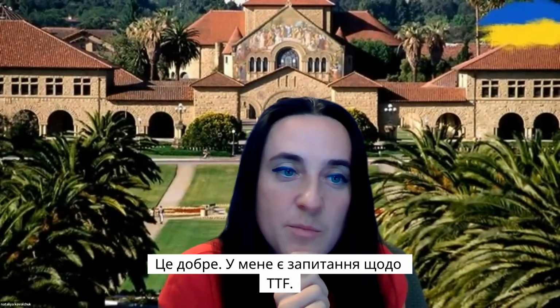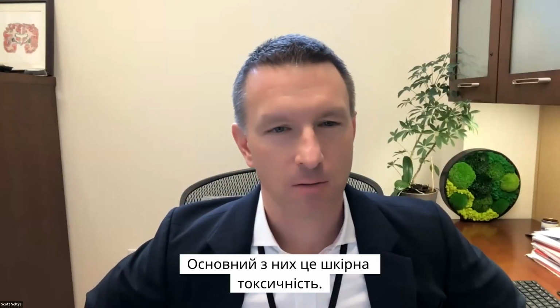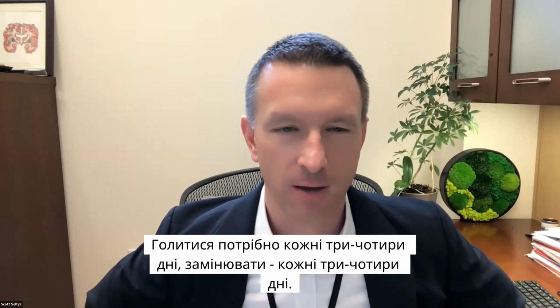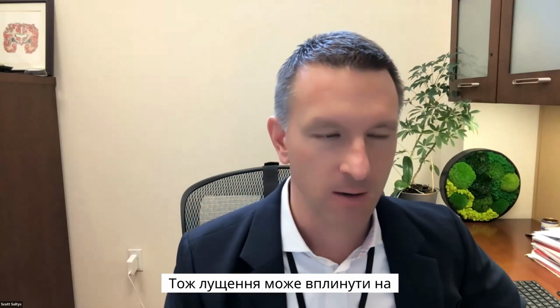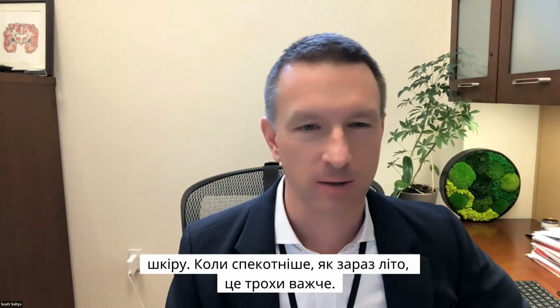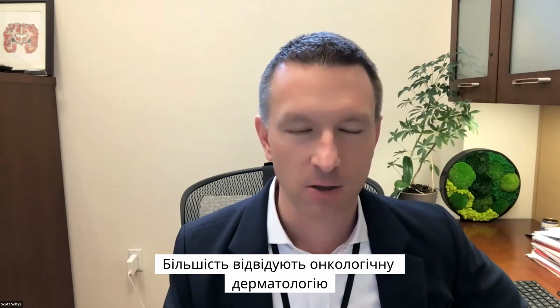Scott, I have a question about TTF. What are the side effects? The main one is skin toxicity. You need to shave every 3 or 4 days and replace the arrays every 3 or 4 days, so the peeling on and off can affect the skin. It's hot, so at summertime it's a little bit harder. Most of the patients end up seeing oncology dermatology here for management.